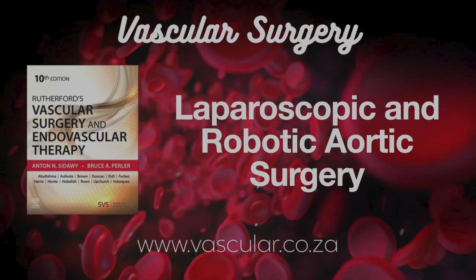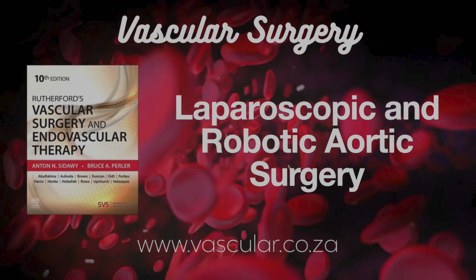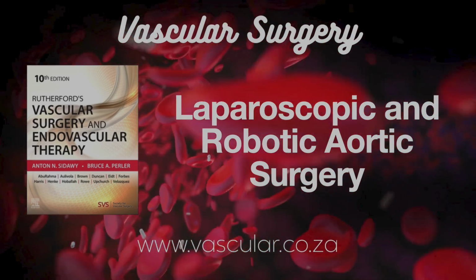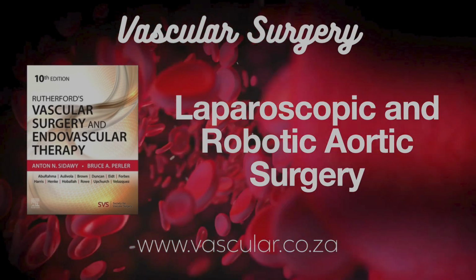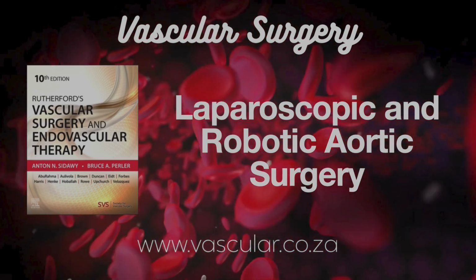More natural movements for the surgeon, then. Tell us about the Da Vinci system. That's the main one, right? Yeah, that's the primary system discussed. It's got 3 main bits. The patient side cart with the robotic arms, an instrument tower for the video and instruments, and then the surgeon's console.